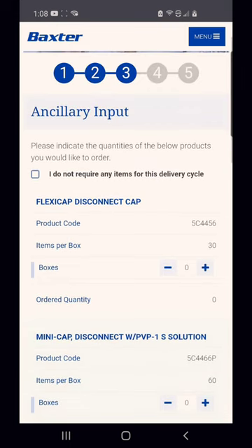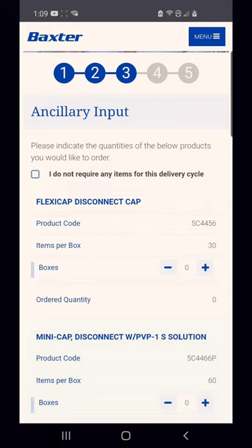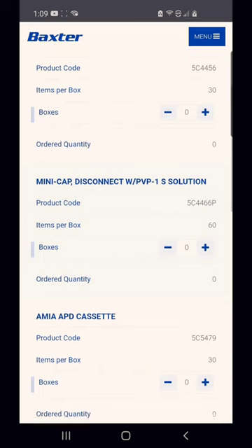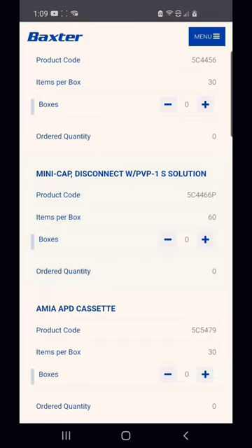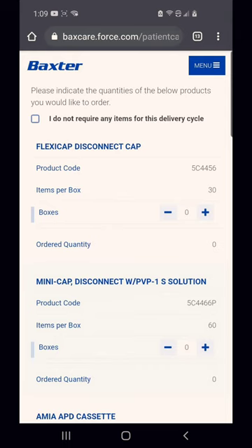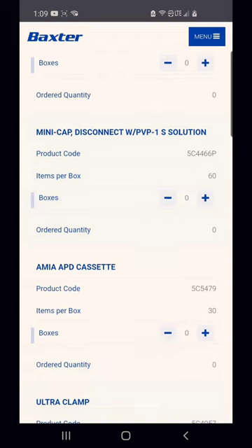So this part is all the extra stuff. The flexi caps are the caps that let you disconnect while you're on the machine for any reason. I have enough, so I'm not going to put any. Mini caps, they give you, I believe, it says 60 right here, 60 per box. So one box should last you 2 months, but if for some reason you're disconnecting yourself using the flexi cap, obviously this is going to finish before the 2 months. So I don't need those. I still have a whole box in my closet, and I still have my current box, which is completely full.